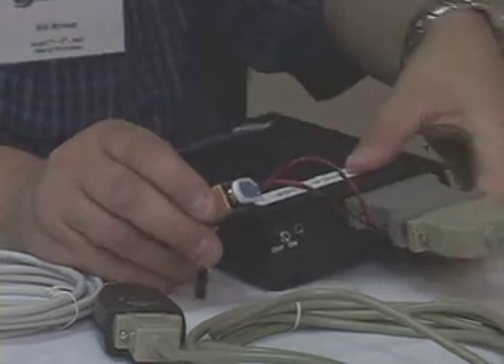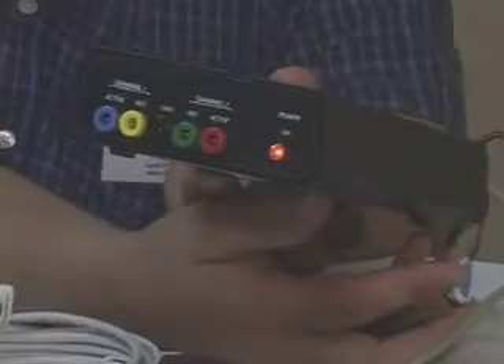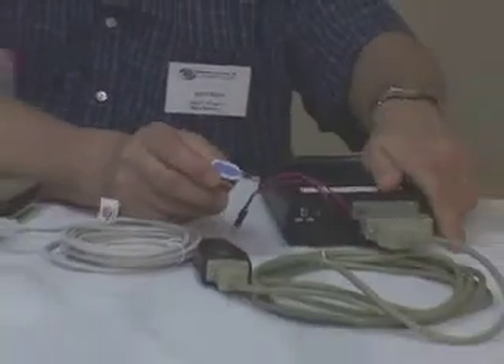Okay — external battery, off position, light is on. Thank you very much.